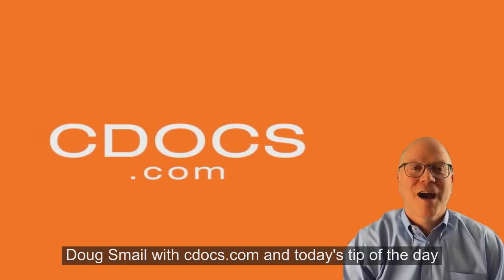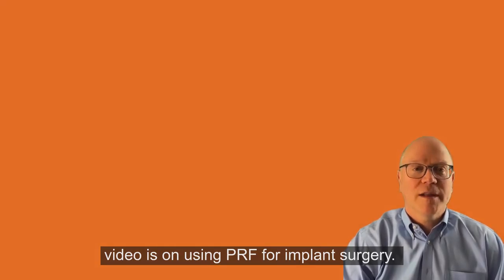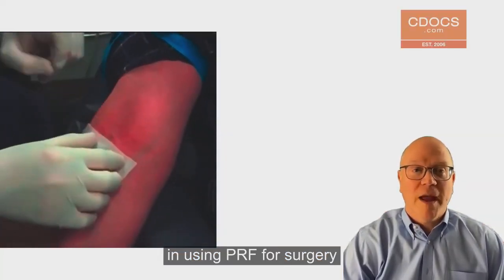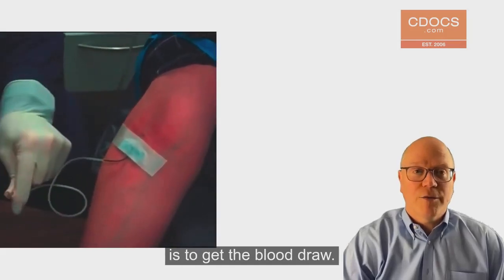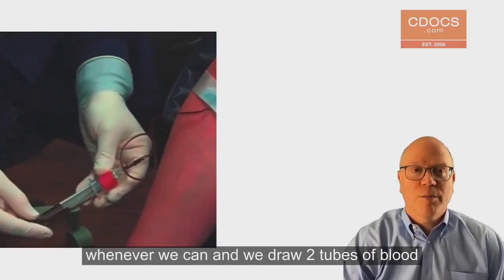Hi, this is Dr. Doug Smail with cdocs.com and today's tip of the day video is on using PRF for implant surgery. The first step in using PRF for any surgery is to get the blood draw. We use the antecubital vein whenever we can and we draw two tubes of blood.